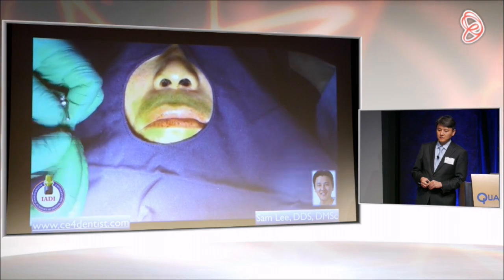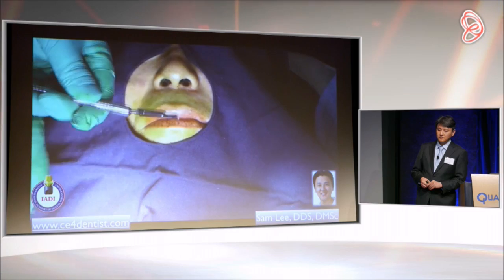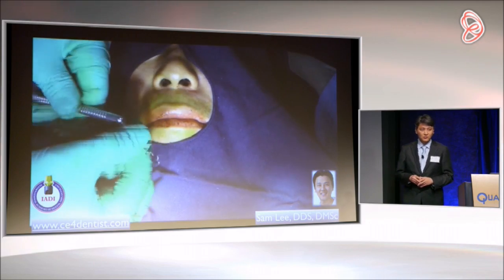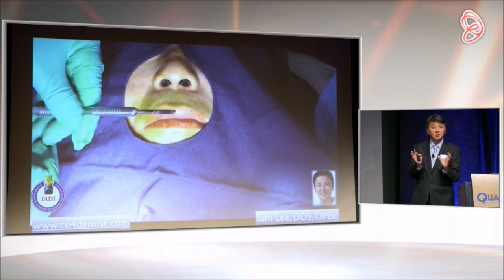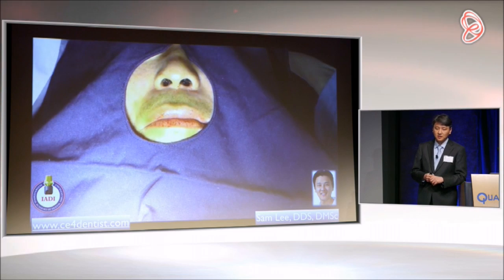Give me another one too, so that I can show them the double blade. So, this is where you can change the angulation. Okay. It's very nice. This makes a big difference when you want to use this straight one, harvesting free gingival graft inside a very small mouth. Okay. So changing the angulation, changing the direction of the blade is very critical to be a good implantologist.